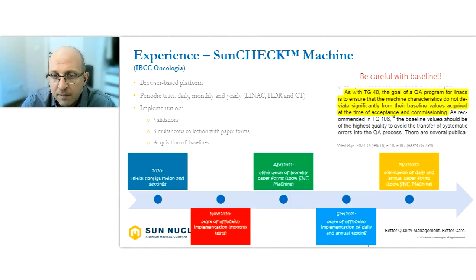Here is the rough timeline of our gradual implementation steps. It was not as fast as we expected because of the high clinical demands that we had in this period and the pandemic period, which is a challenge for a lot of radiotherapy departments. So we chose a gradual, step-by-step implementation for each functionality of the system.